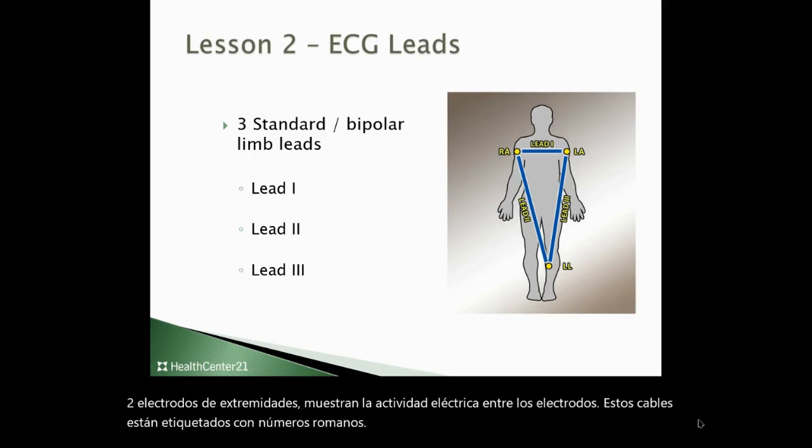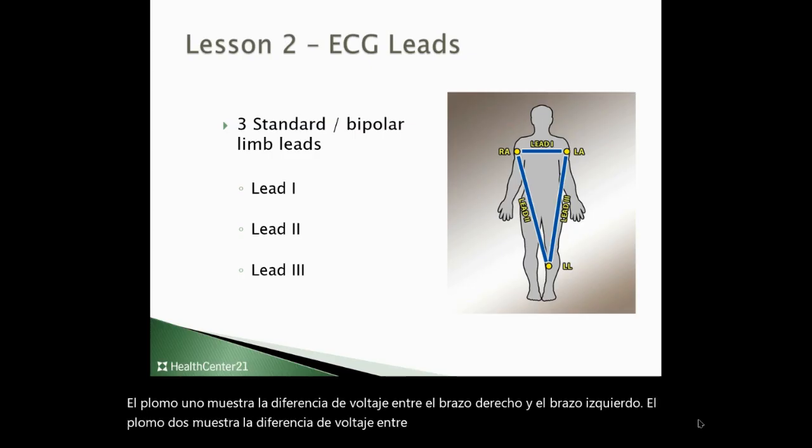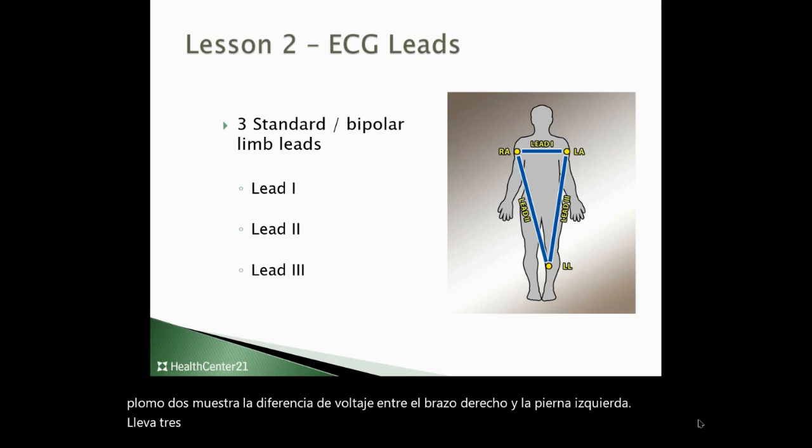Lead 1 shows the voltage difference between the right arm and left arm. Lead 2 shows the voltage difference between the right arm and left leg. Lead 3 shows the voltage difference between the left arm and left leg.